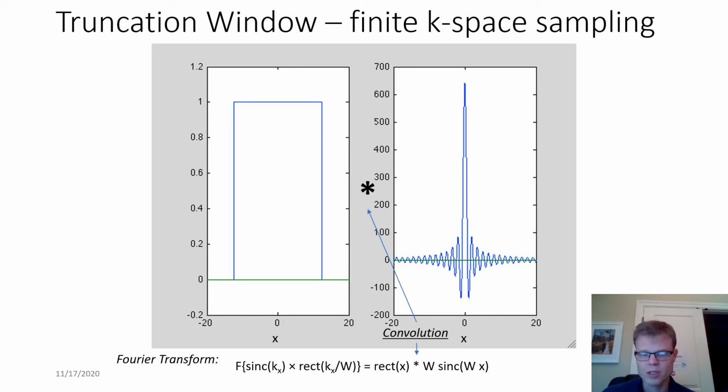This convolution operation is denoted by the star here, not to be confused with a multiplication. So we're going to have a convolution of the Fourier transforms of these individual functions that were multiplied: our rect object, what we hope to recover, convolved with, actually now, a sinc function. And this is basically the non-idealities. The sinc function at the right here represents the effect of the finite sampling.